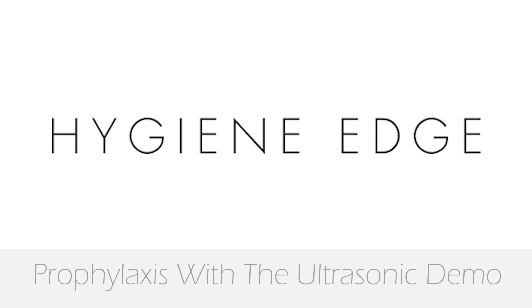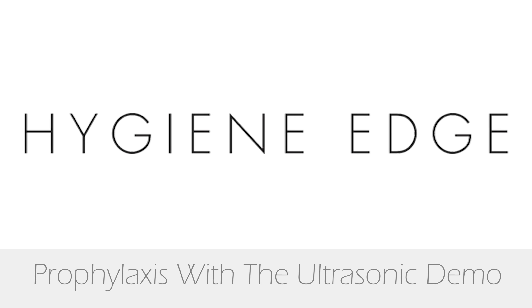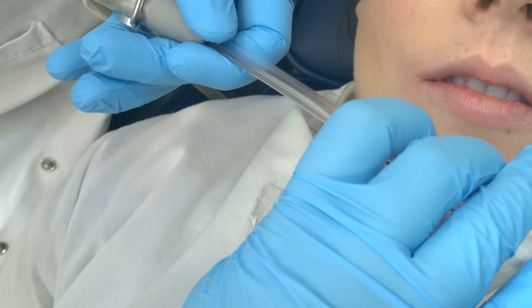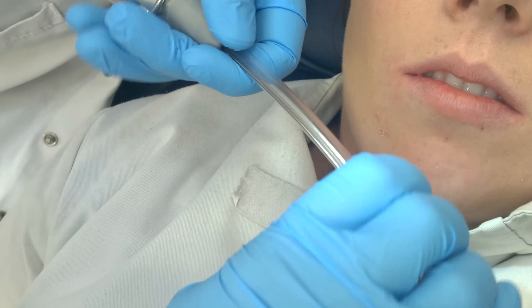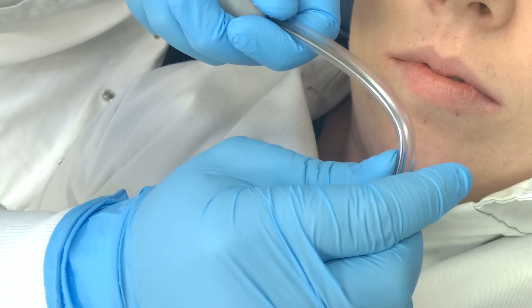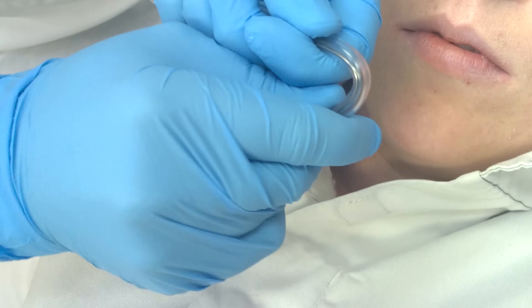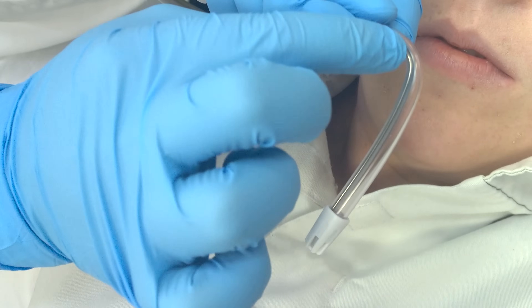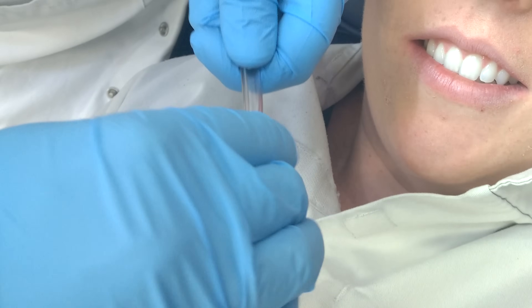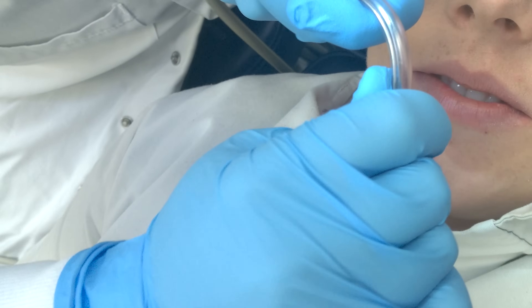The first thing we need to do before we use the ultrasonic is make sure our suction is working correctly. Here I have the suction tip and I'm going to take it in my hand, curve my fingers around it and use my thumb to push, because I like a curve and not a kink. If you just bend it quickly it creates a kink and the material gets stuck in the suction, so you want to create a nice smooth curve in the suction tip.